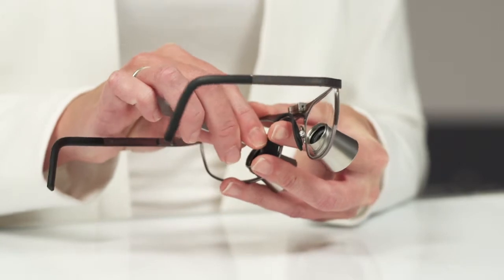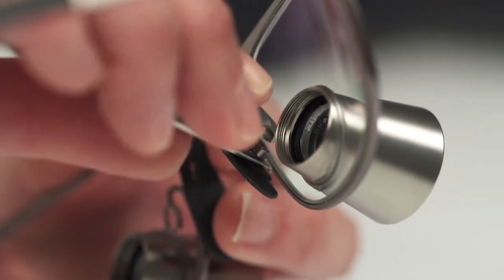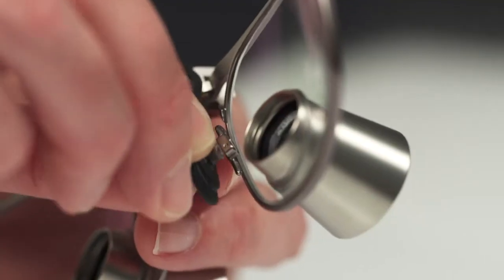Take the Nose Pad Remover Tool. Click the nose pad out of the nose pad arms, like this. Take care not to scratch your lenses. Your ExamVision dealer can supply you with a new nose pad in the correct size.